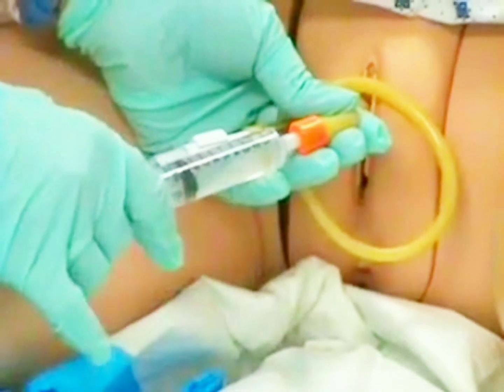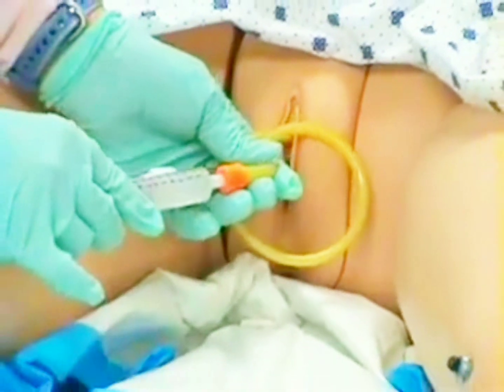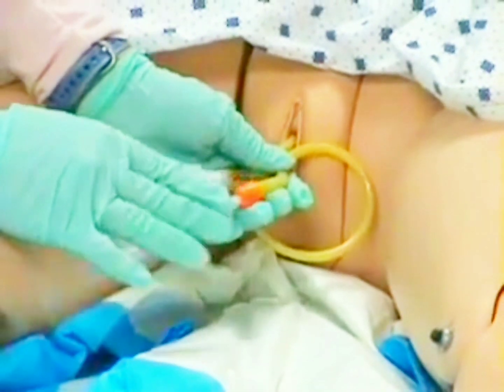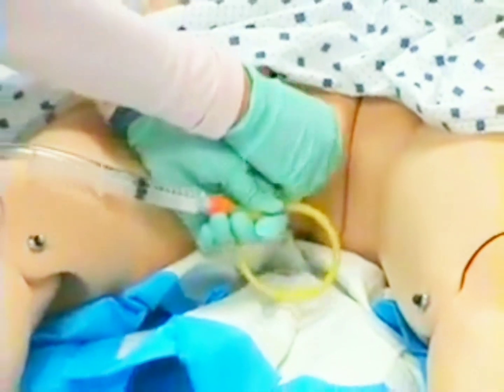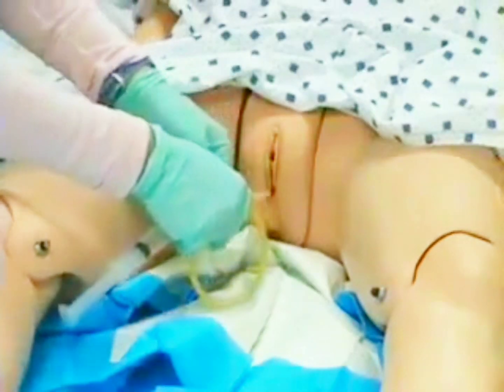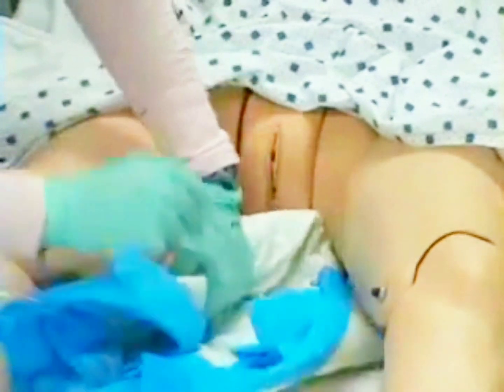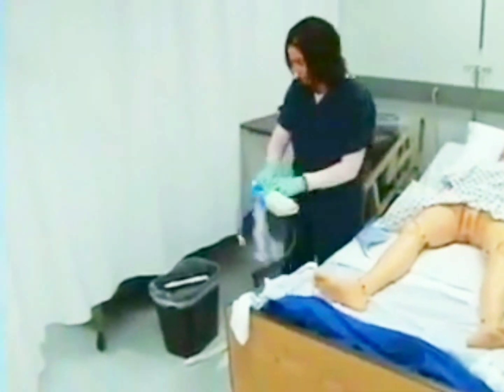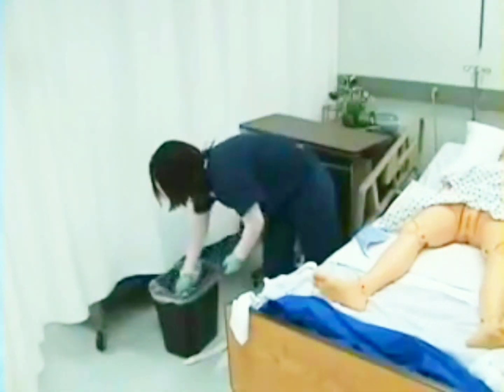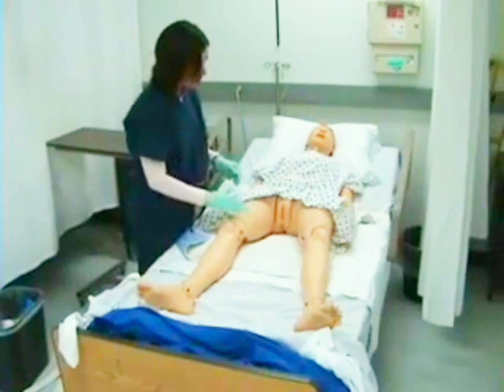Mrs. Doolittle, I'm going to go ahead and remove your catheter. You can just take some slow, deep breaths. You may feel a little pressure and we will be done in just a moment. I will place the catheter on my absorbent pad and wrap it up, then dispose of it in the trash.